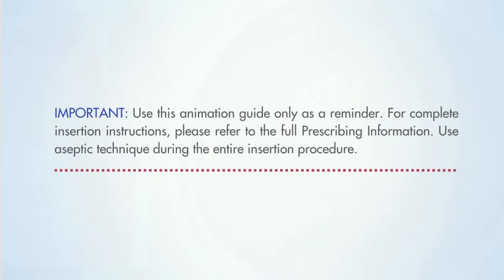Use this animation guide only as a reminder. For complete insertion instructions, please refer to the full prescribing information. Use aseptic technique during the entire insertion procedure.